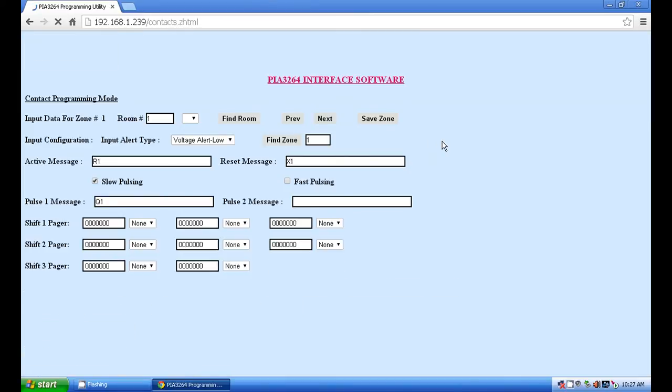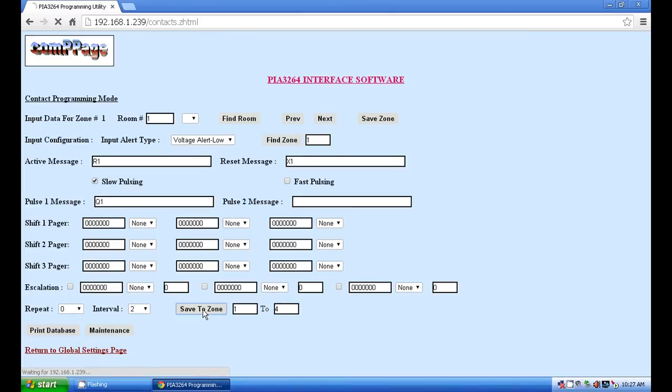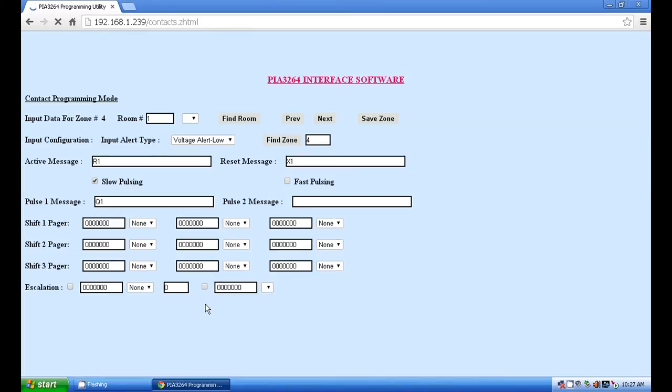In order to use zone 1 as a template for the remaining zones, in the save to zone section, change the to box to reflect the number of points to be programmed. Click save to zone and the window will display the last zone entered. In this case it is zone 4.